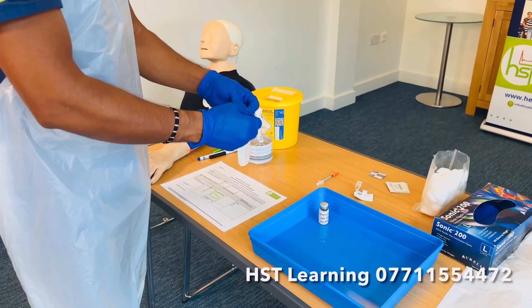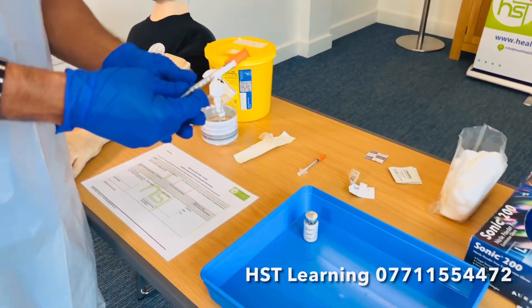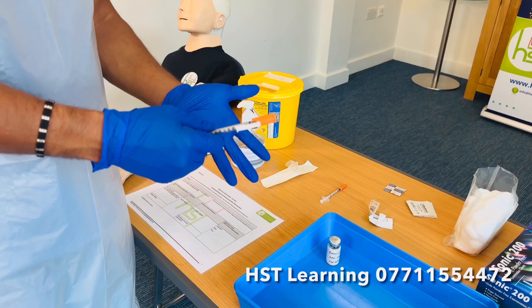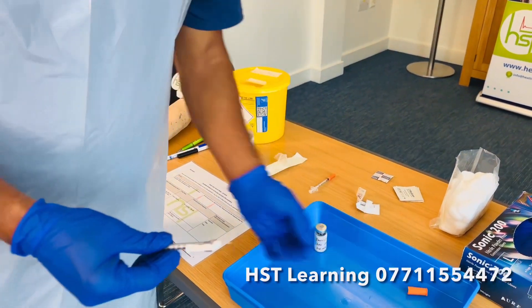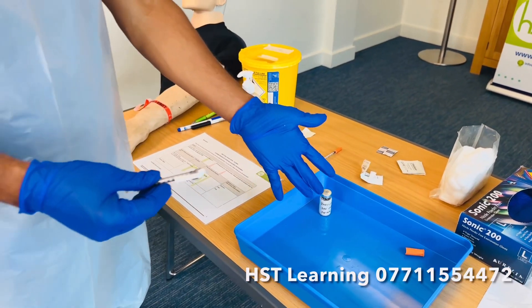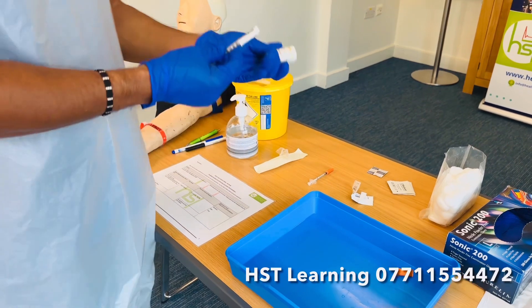Now I'm going to prepare the medication. I'm going to peel open the syringe — I'll use the safety syringe, which is where a lot of people struggle. Take the cap off and save the cap in the tray, but with these new changes you don't need the cap anymore. Now I'm going to draw the medication.